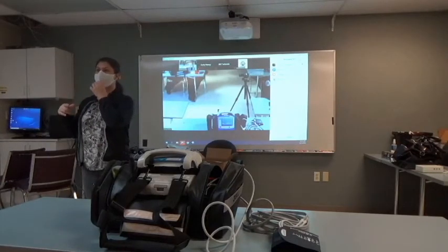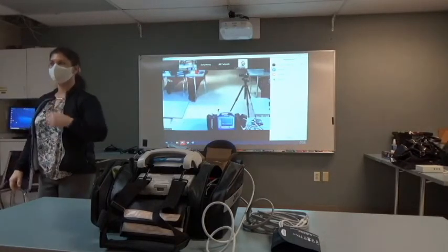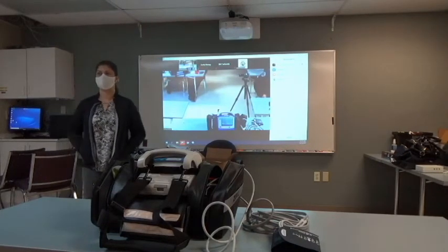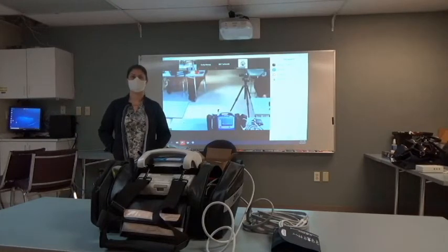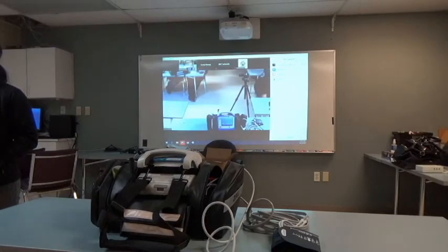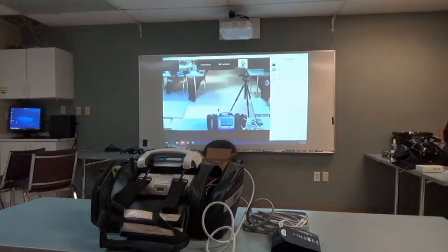So you'll hit your charge button. You have two ways to do it. Either hit the disarm button or hit your energy select button to disarm. So you can either hit the disarm button on the right hand side, which is the third button down soft key after you charge, or if you hit the energy select up or down, it will change energy and disarm. Good job. Very good.